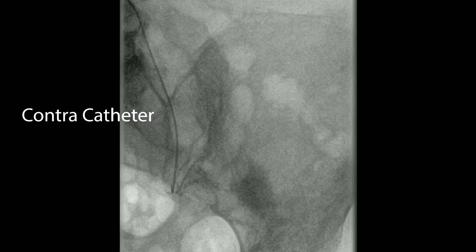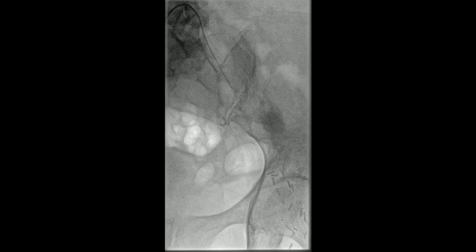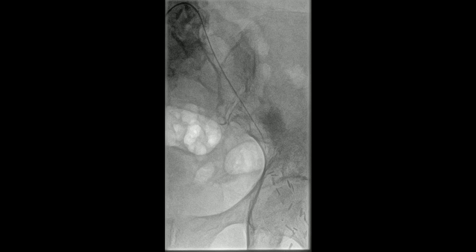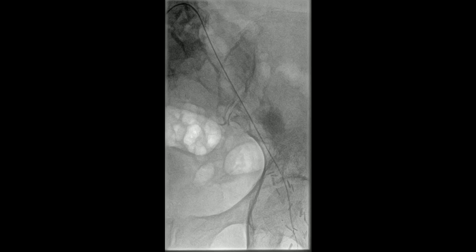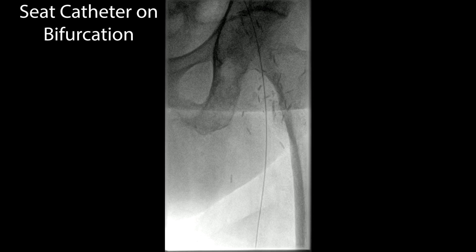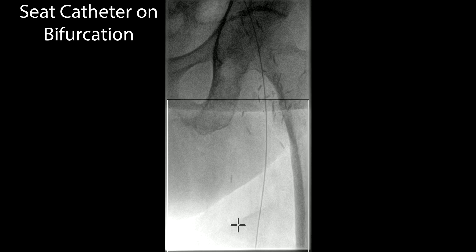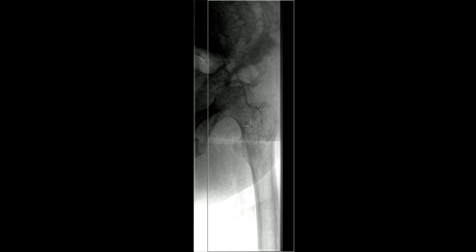The contracatheter is now used to deflect a floppy glide wire down the opposite side. You pull the catheter down so that it engages in the bifurcation and then advance the wire — it'll frequently end up in the internal iliac, in which case you need to redirect it. You can see all the clips in the groin from multiple prior operations. You want to get enough wire to exchange a catheter.